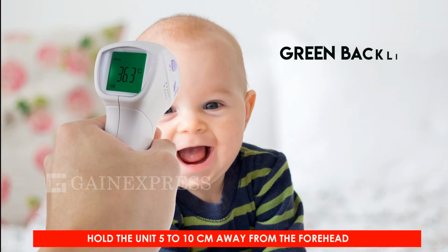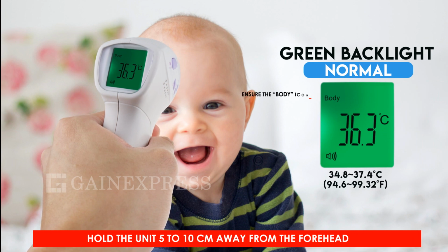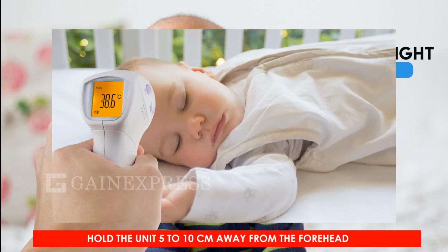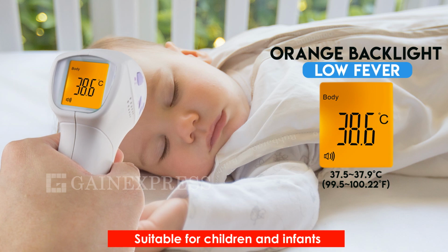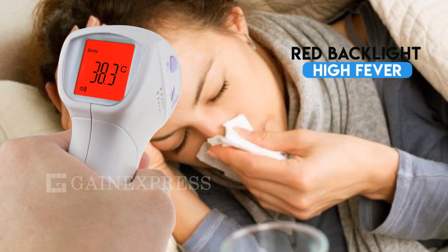Green backlight if the temperature is within 34.8 to 37.4 degrees Celsius. For low fever, the backlight will turn orange. Red backlight means high fever.